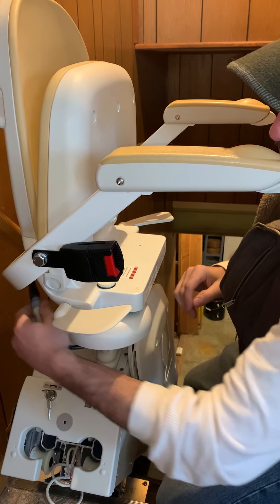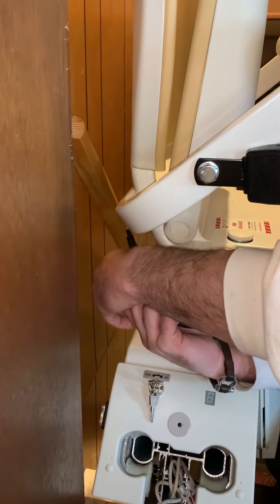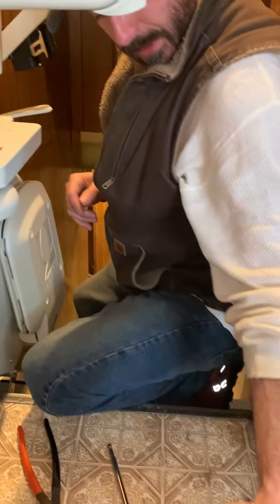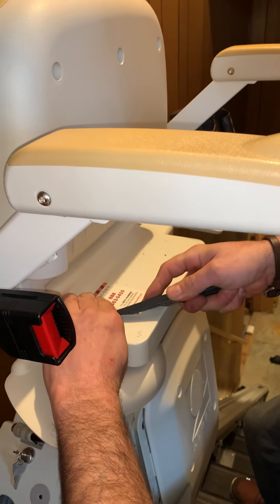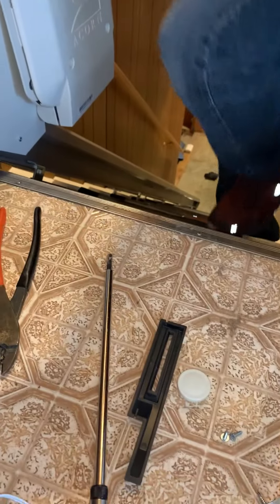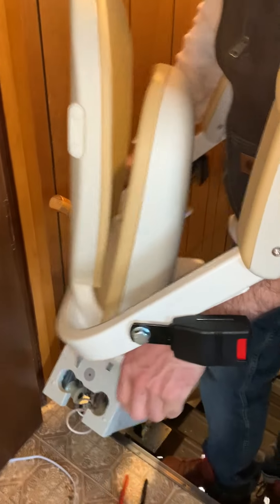Let's unplug the seat. Now this little guy here does have to come off. Now we can just lift the seat right up. Set that aside.